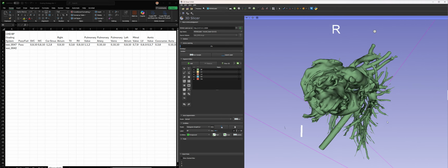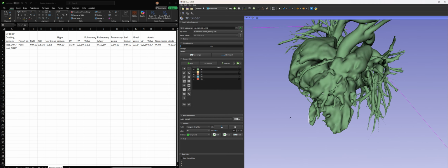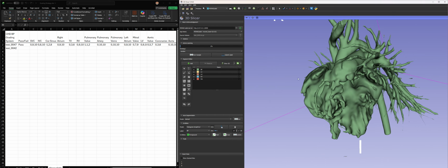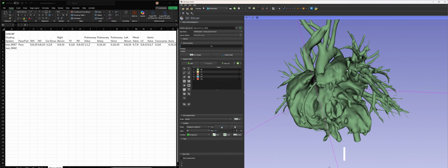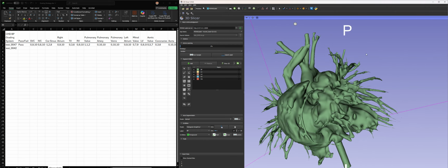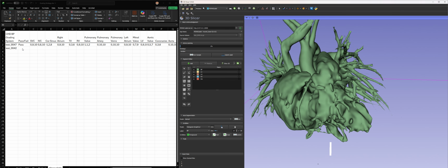We're not fighting. If there are structures that are absent due to congenital heart disease, just put not applicable. So if there is no pulmonary artery, like a pulmonary atresia case, just NA, no pulmonary artery, or pulmonary valve, and that sort of thing. So anyway, what do you guys think? I think it is a pass.